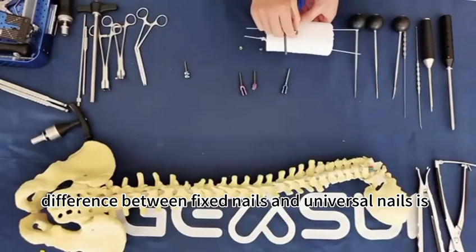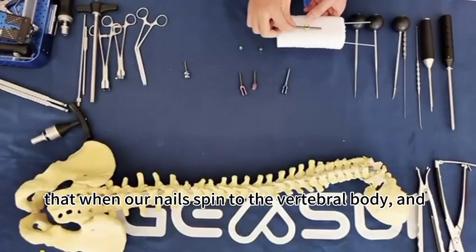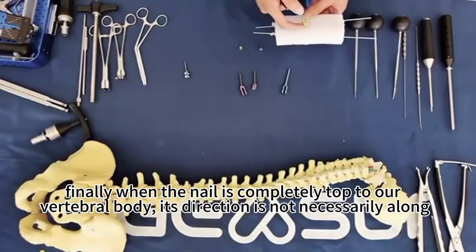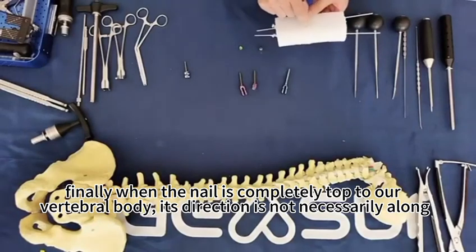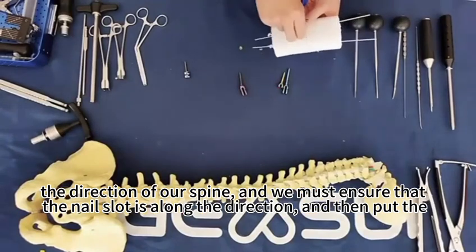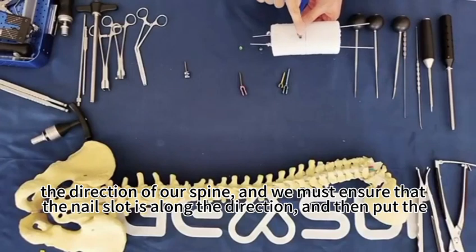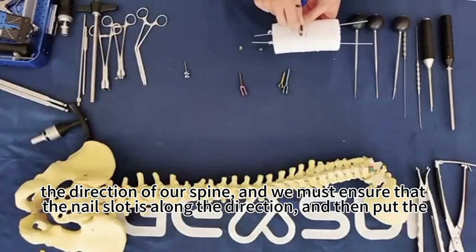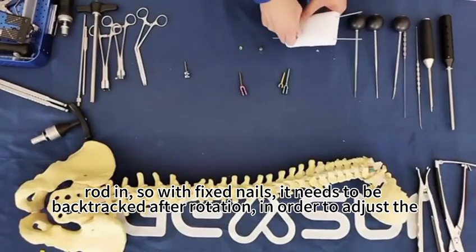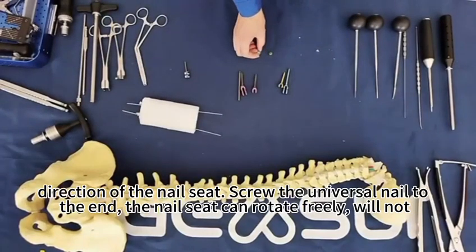Then the difference between fixed nails and universal nails is that when our nails spin into the vertebral body, and finally when the nail is completely tapped into our vertebral body, its direction is not necessarily along the direction of our spine, and we must ensure that the nail slot is along the direction, and then put the rod in. So with fixed nails, it needs to be backtracked after rotation in order to adjust the direction of the nail seat.